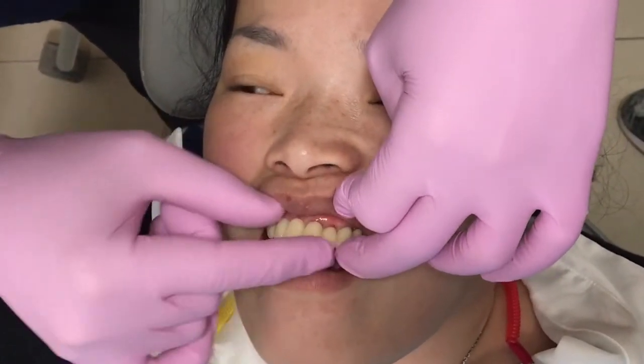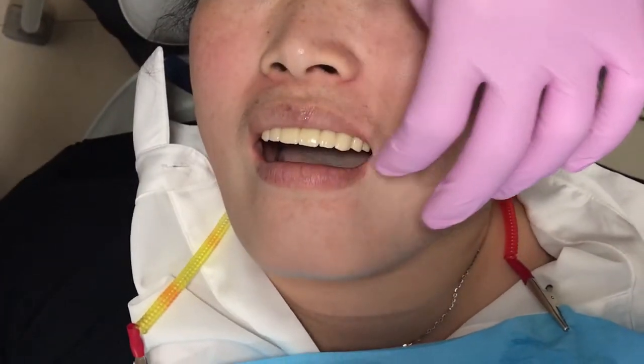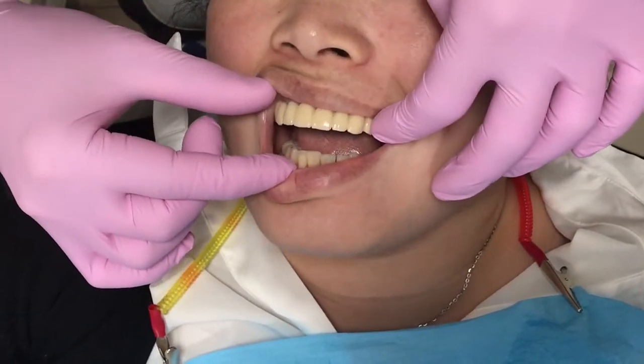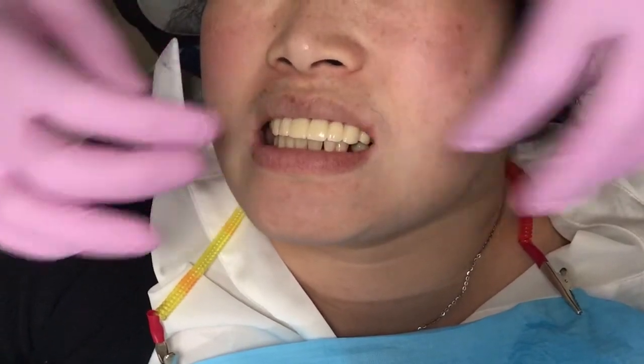This material is zirconia. Zirconia is not super transparent, but it's a stronger material. I'm going to put it in the front.